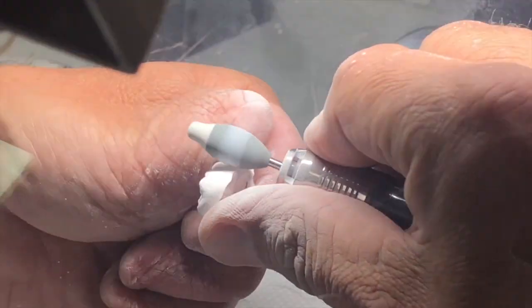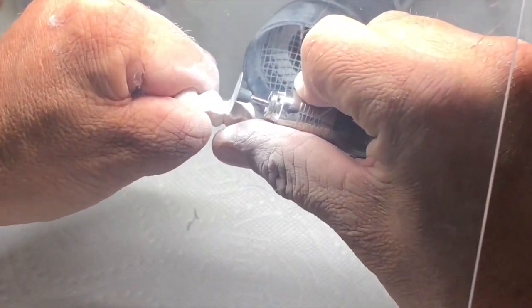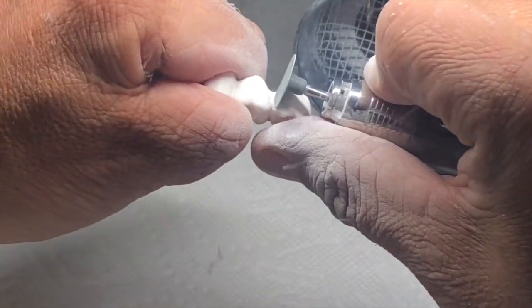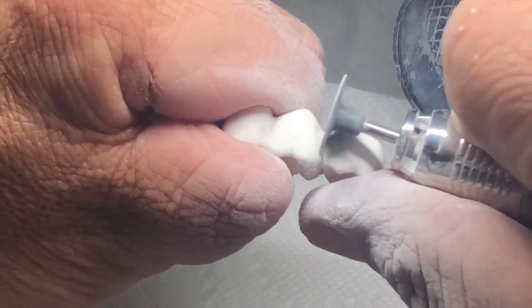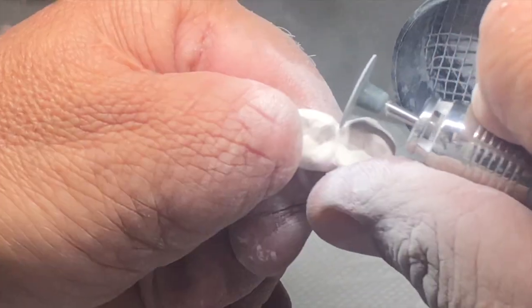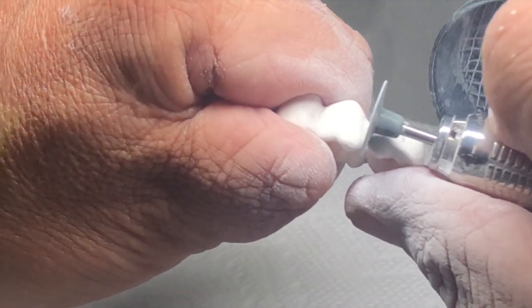Once I get that down to where I like it on a bridge, I will use this really thin rubber wheel to get my interproximal so I can polish those down. I can separate them a little bit more if I need to — just take it real lightly. Don't press too hard with this wheel or you'll put in cut lines.